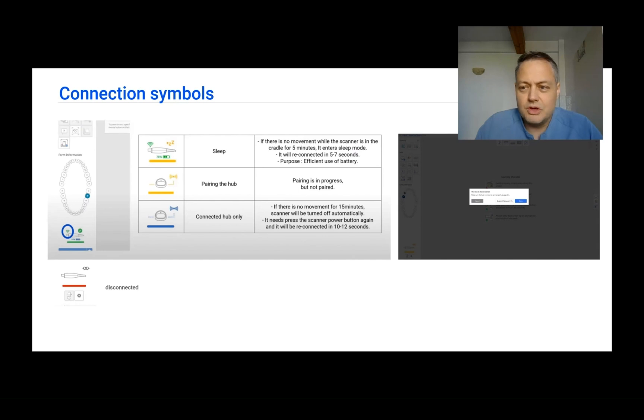The symbols are going to tell you if the scanner is connected, if the scanner is sleeping, if the hub is active when you are using a wireless scanner, or if only the hub is connected. For wireless scanners you will also see the percentage of battery remaining. When you are going close to 20% I would recommend swapping the batteries and putting in a new one, because you won't want to stop scanning and replace it mid-scan.